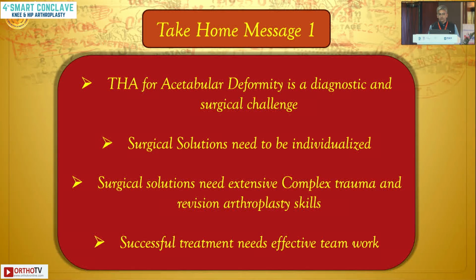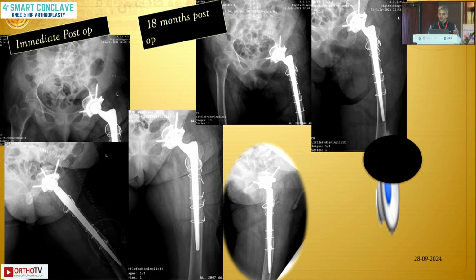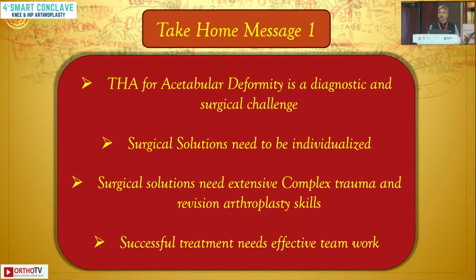So I'll not walk through this case. This was another patient where we did a cup cage construct for an intrapelvic cup.